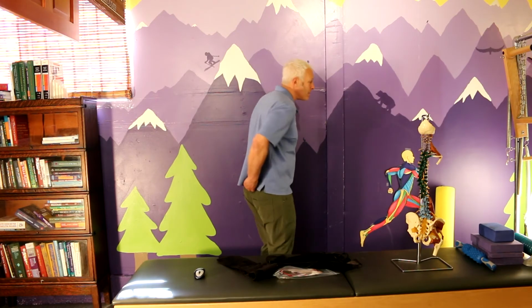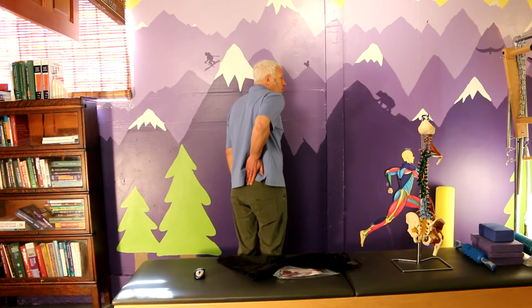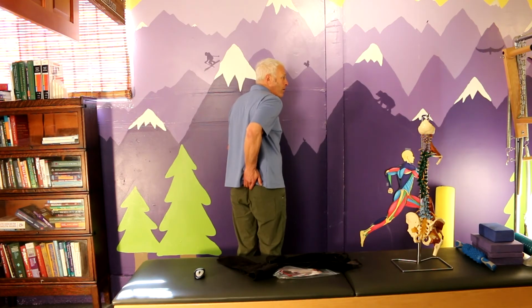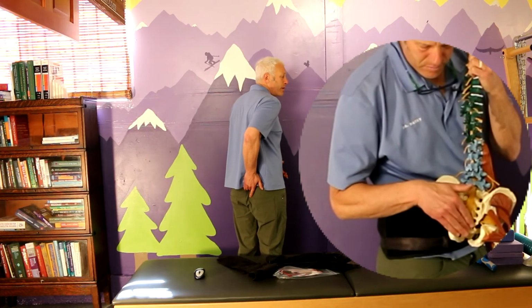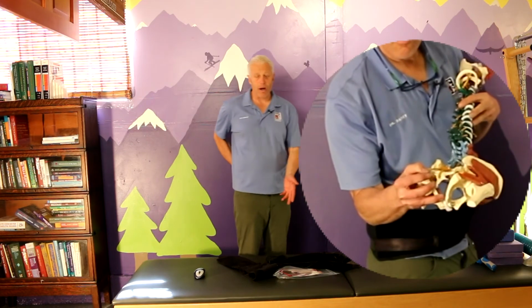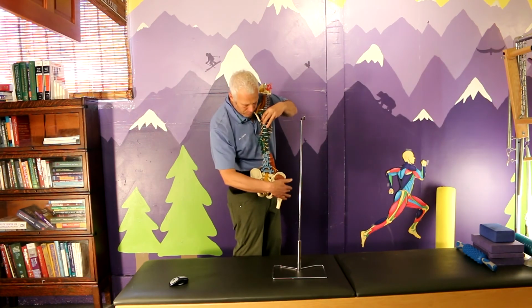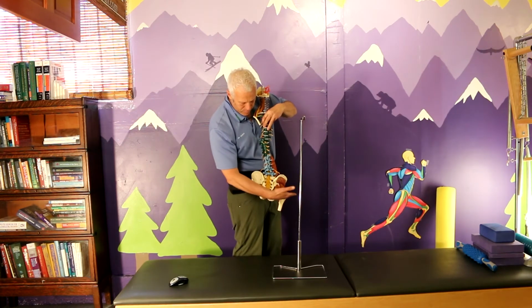And to find the coccyx, another way is that if you find your butt crack and you kind of palpate, you're going to feel a hard bone underneath the skin, and if you just come down low enough, it's going to disappear. And right where it disappears, that's where the coccyx ends and where you're going to want to have that brace. But the easier way to find that, I think for most people, is to find the greater trochanter. And that's going to be the better way to do it.